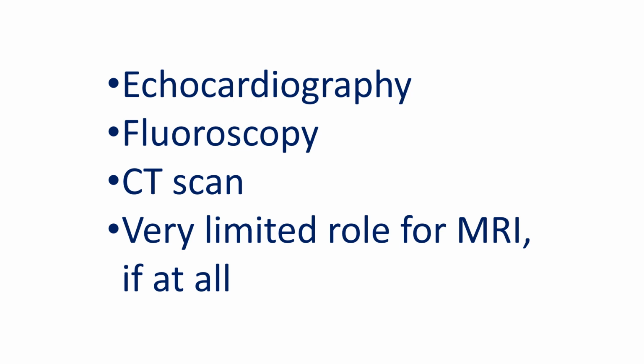Most commonly used methods for evaluation of prosthetic valve are echocardiography and fluoroscopy, but they may not identify morphological substrate or the extent of prosthetic valve pathology. In such situations, cardiac computed tomography and magnetic resonance imaging are other potential imaging modalities.